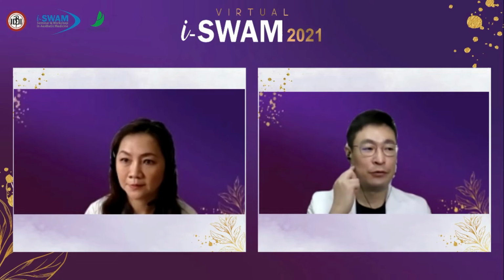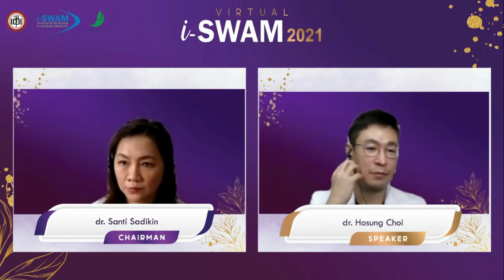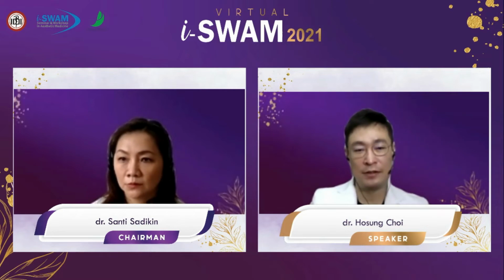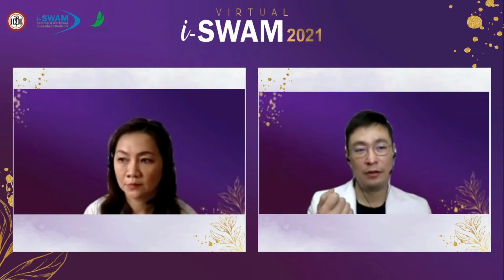So I should fill about 70% only, because I'm not injecting only the filler. I put first 50 to 70% of the volume loss, and then I put the thread to reposition this part to fill the sunken area. And then the filler can act as a tumescent, and it can release the ligaments, and the thread will be more easily inserted.